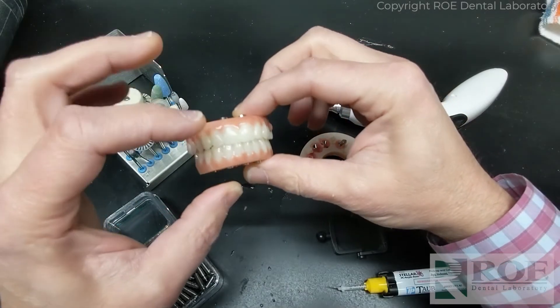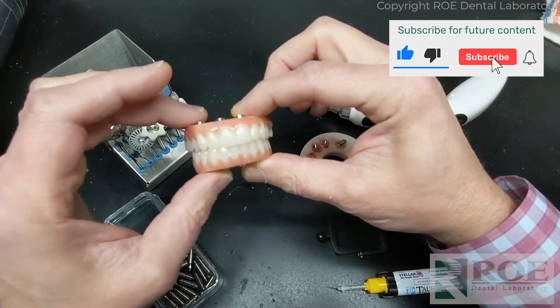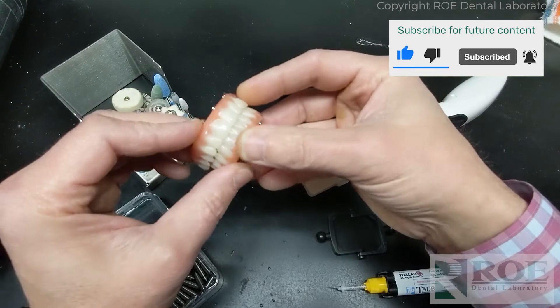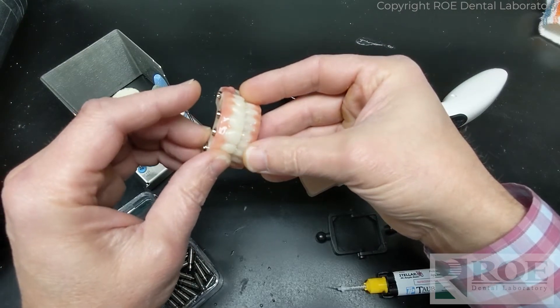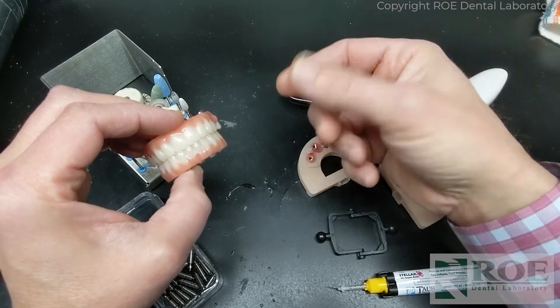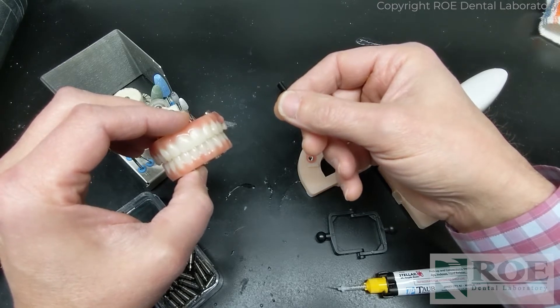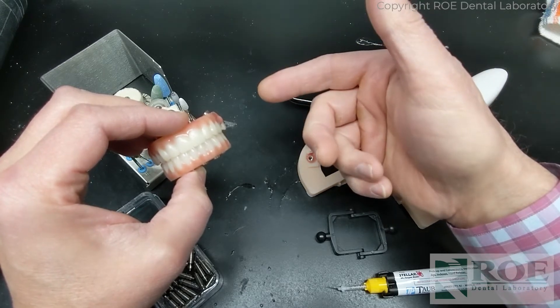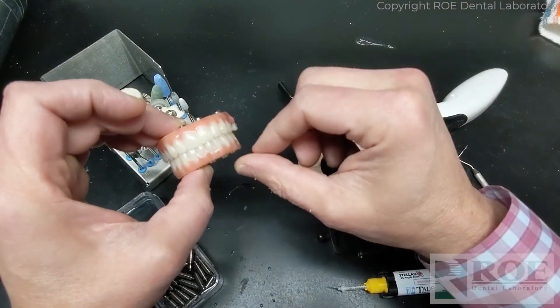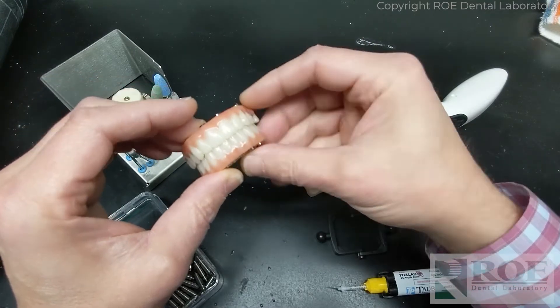This video shows how to take the rapid appliances, which now have pink, and clean them up, fill the holes, and prepare them for the patient to wear home. What we're suggesting now is that the take-home prosthetic the patient is wearing currently after surgery is the prosthetic to use for the bite registration and all the records for going to a final. So send those prosthetics in and put these in the mouth.